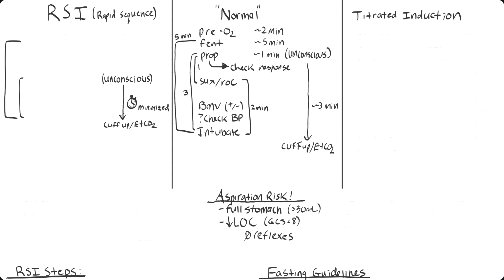So to do an RSI, we'll start by pre-oxygenating, just like we did for our normal induction. But I would almost say that pre-oxygenation here is much more of an important step, and we should emphasize this because you are not going to bag mask ventilate these people.